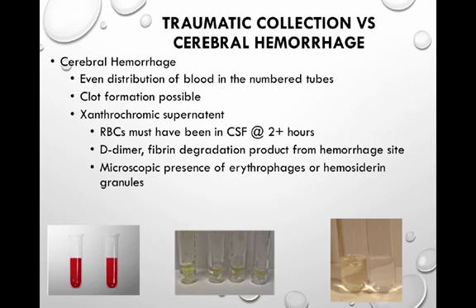On the microscopic differential, we may find erythrophages, macrophages that have ingested red blood cells, and hemosiderin granules, which indicate intracranial hemorrhage and not a traumatic tap.